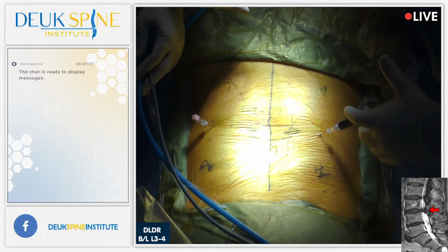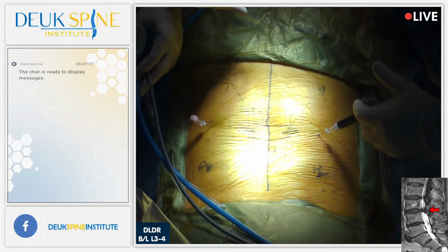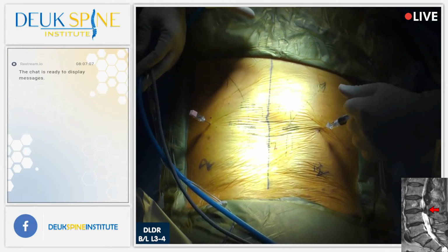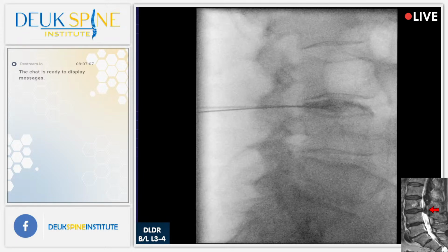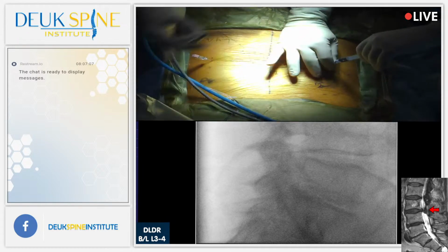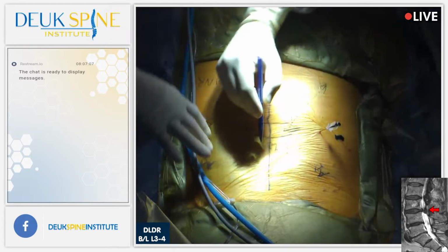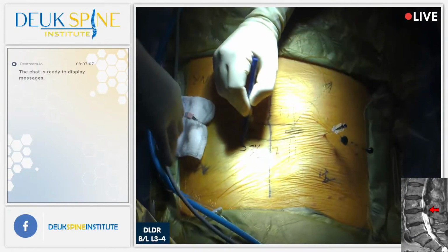You okay? Doing okay? So I don't tell the patients when I'm going to inject. I don't want them to know. See that? How bad is that on a scale of 1 to 10? 10. All right, that's a 10 out of 10. Is that where you get your back pain? Yeah. He said yeah. So that was a 10 over 10 pain, guys. That is perfect. That is what we want, and it's concordant.